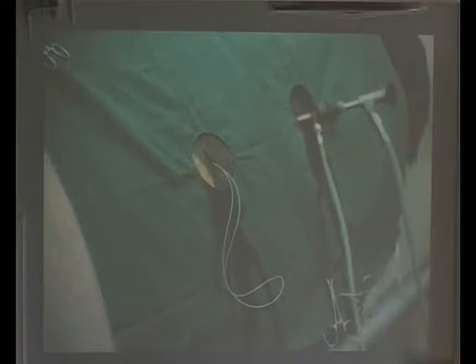And another problem in the beginning was the thread after bringing in the toggle into the abomasum. If you brought the toggle into the abomasum and the abomasum is deflated and sank down, bring in the thread completely. We started with the thread out and then turned over the cow, but it's difficult then to find the thread in the abdominal cavity. So every time, bring in the thread completely after deflating the abomasum.